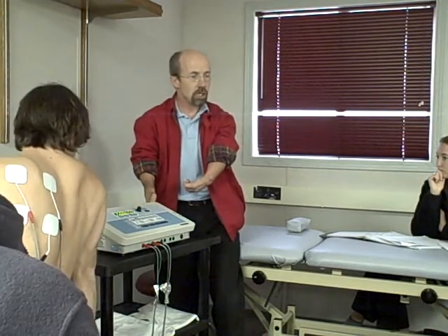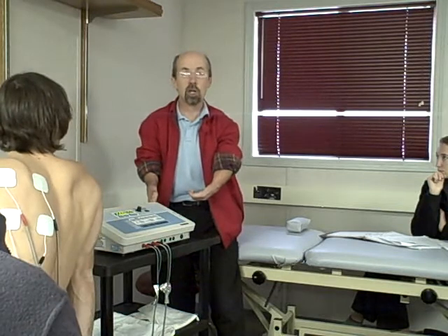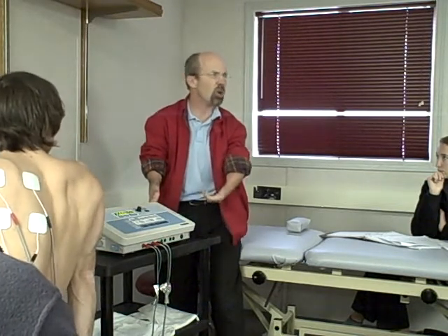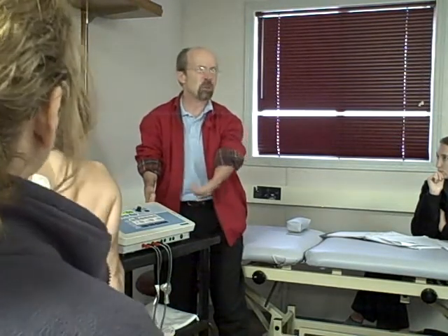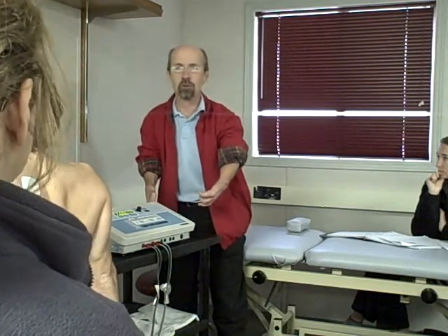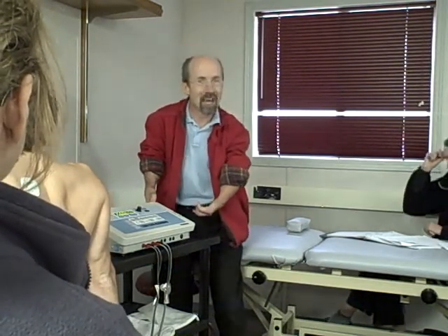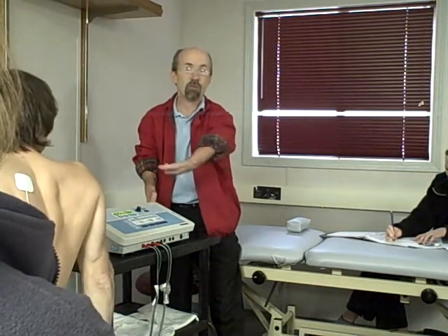Okay? Now, in terms of sensation, again, it kind of depends. Could I turn quadpolar interferential up so high I could get a muscle contraction? Well, you could, but if you want a muscle contraction, that's not the best way to do that. If you want really efficient muscle contraction, that's why you go to Russian. So again, we're focusing on pain control. We're not looking for muscle contraction. You probably want to go up to where they feel it, maybe a little bit higher, because your body will acclimate over even 2, 3, 4, 5 minutes.